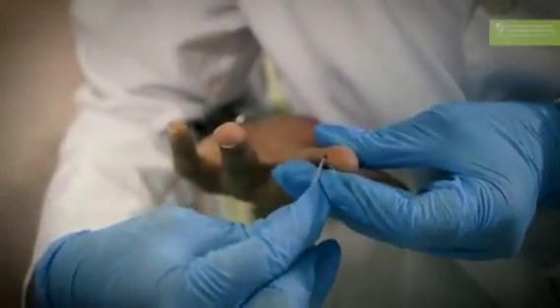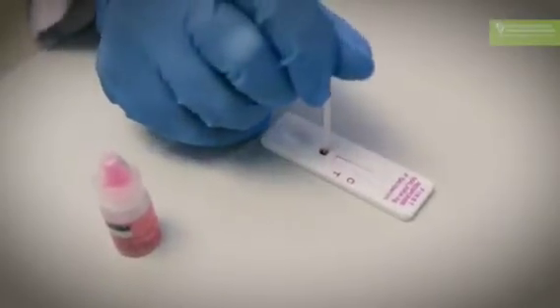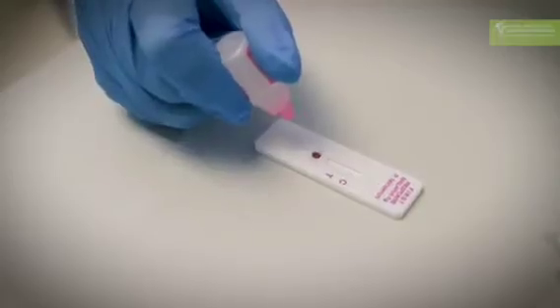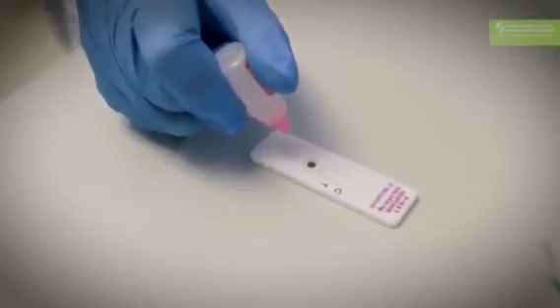The pipette has a cup which ensures you collect enough blood. So you take the blood and you put it into the blood window of the RDT, and that's all the blood that you require. And you just add 2 drops of buffer into the buffer window. Do not squeeze this like a ketchup bottle. It's very gentle, so you get 2 small drops that come out.